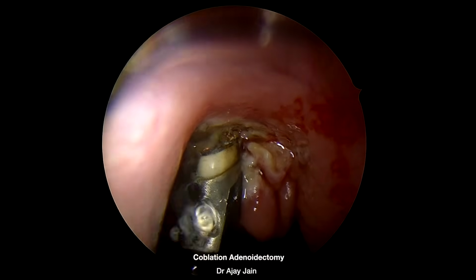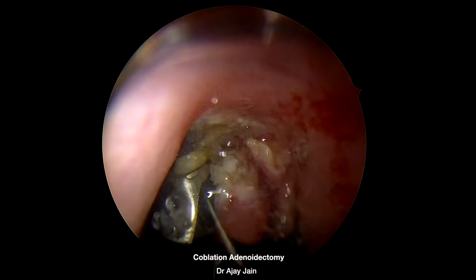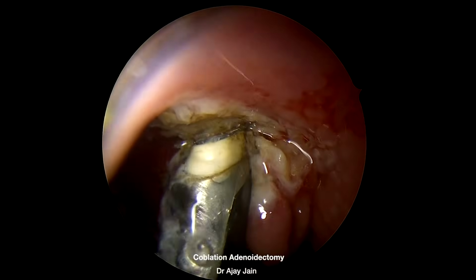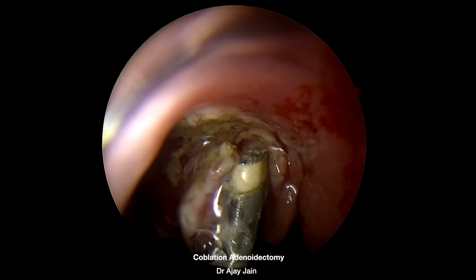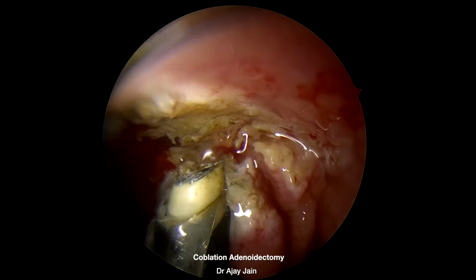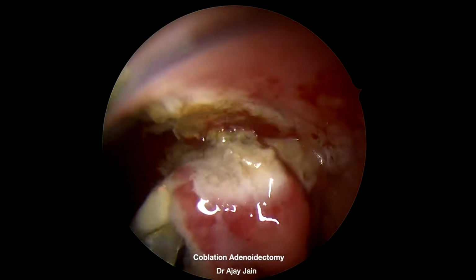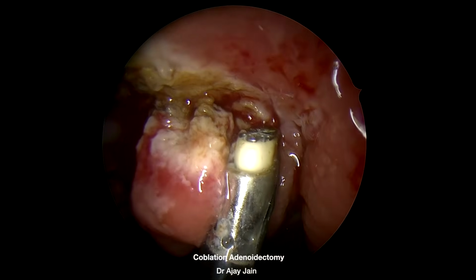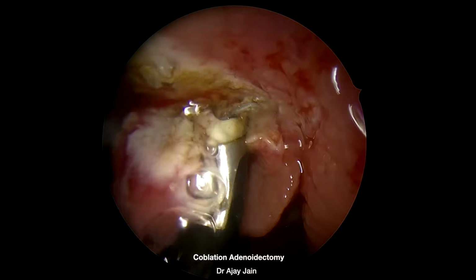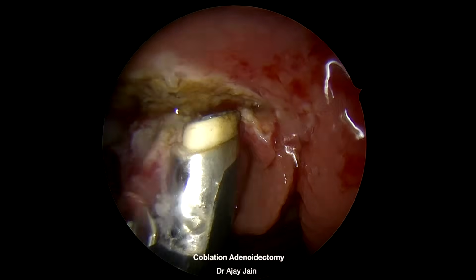Right side, since she is a slightly big girl, my wand was not reaching superiorly. Otherwise, I like to start from superior to inferior, but whatever you are comfortable with, you can do in your own way. But this is my favorite method, superior to inferior.